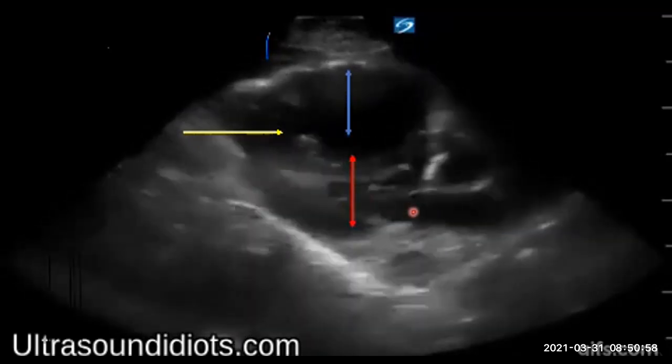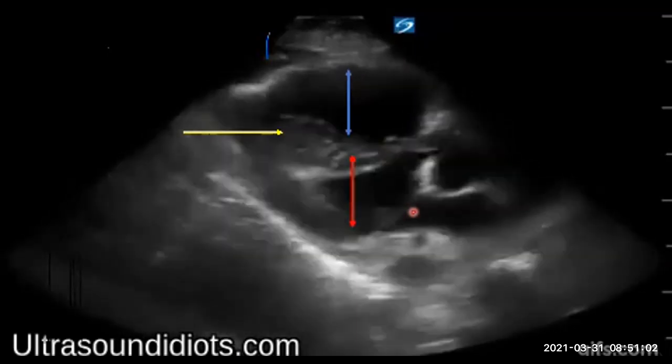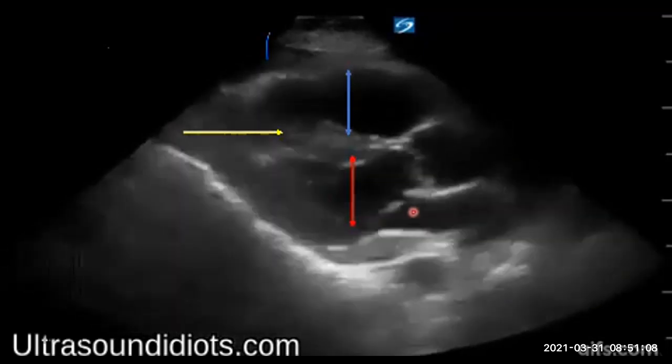The second thing is the ECG findings are completely different. All right, so COPD patients tend to have something called multifocal atrial tachycardia, which looks completely different to what we saw in our ECG.